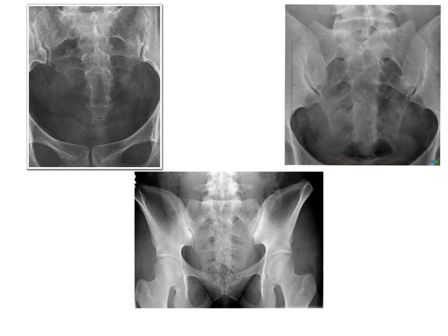Today we are going to review our sacrum, coccyx, and SI joint projections. And what you will see on your screen in front of you are our AP axial projections. And if you look to the left-hand corner, you've got coccyx, AP axial coccyx.